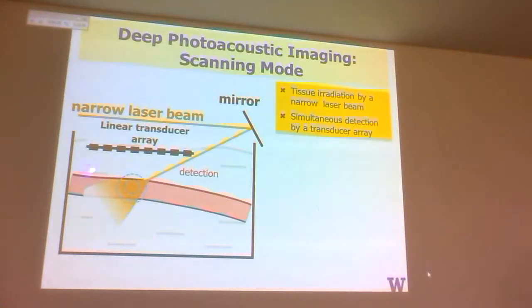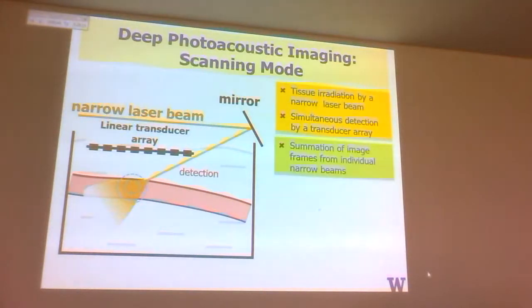And try to manage, in terms of the optics design, the best trade-off, because you're going to have this diffusion of the light as it goes in. You know you're going to diffuse the light. So managing the number of fibers, the repetition rate, all those things is an optimization or trade-off problem.